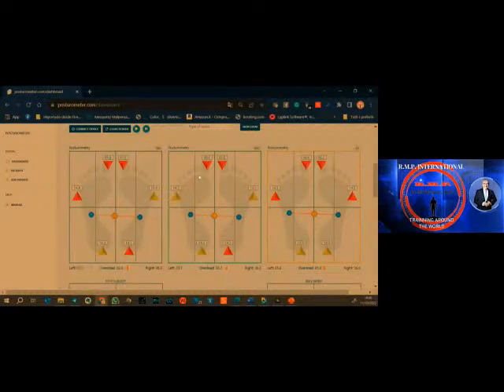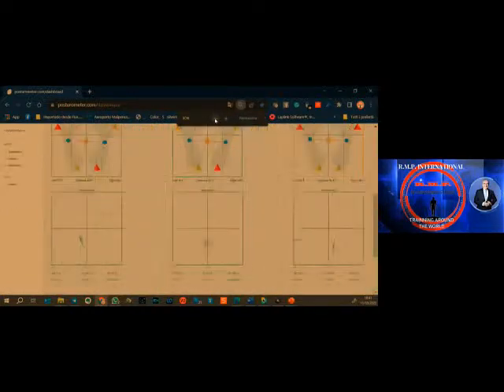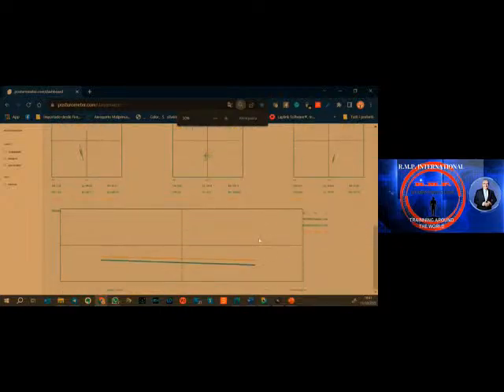Okay, and then if you're going down, we do short reading because I am in the screen. We see here central body center and foot support. We can do diagnosis of the body center with the values. There are 3 simple values you need, and the foot support. And also you have here the torsion of the body.